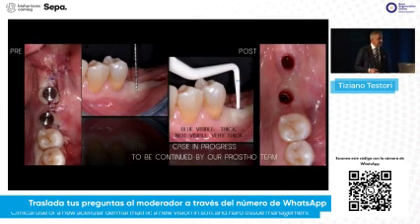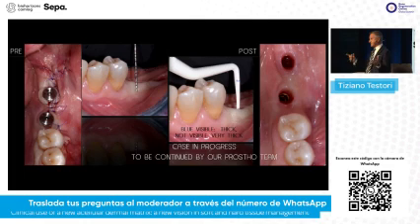On the implant side, we started and we ended up with thick, not visible, very thick periodontium. So we have achieved our goal on the perio side and on the implant side. On the perio side, using the matrices as a normal connective tissue graft with a coronally advanced flap and the bilaminar flap.